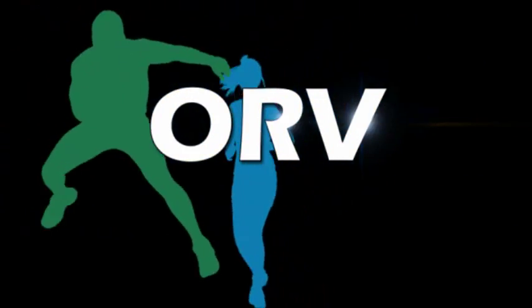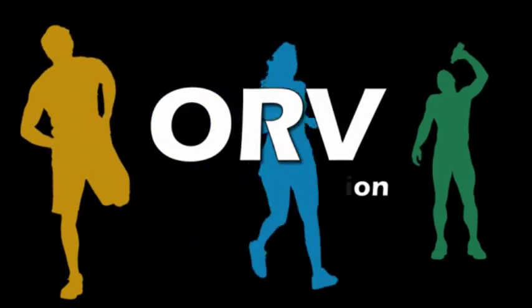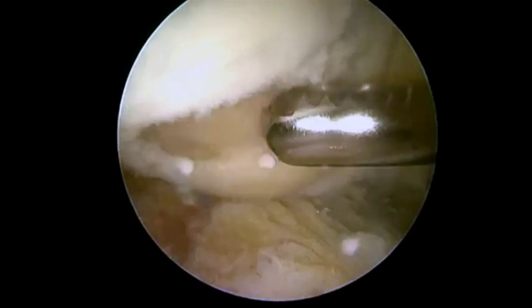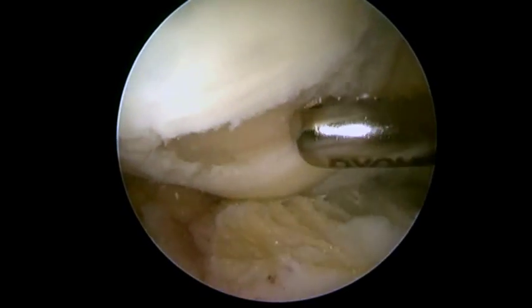Hello, this is Dr. Chad Lavender from Orthopedic Research of Virginia, and in this video, we will present arthroscopic techniques in the use of BioCartilage from Arthrex in the patellofemoral joint of the knee. The first case is an isolated patellar lesion with no maltracking.